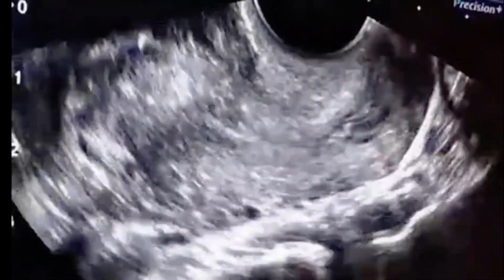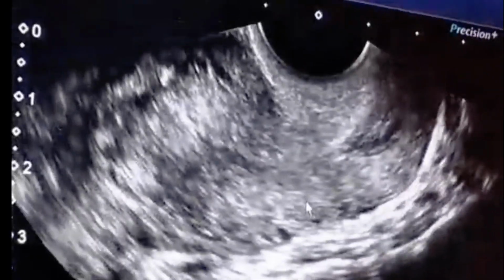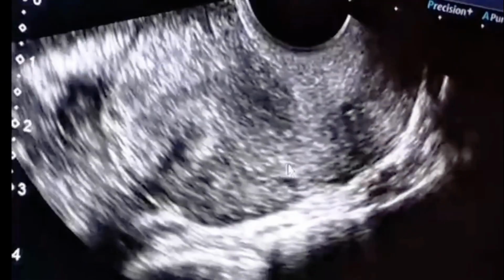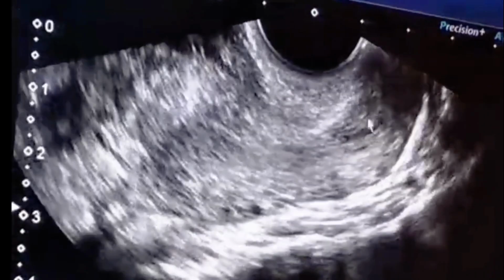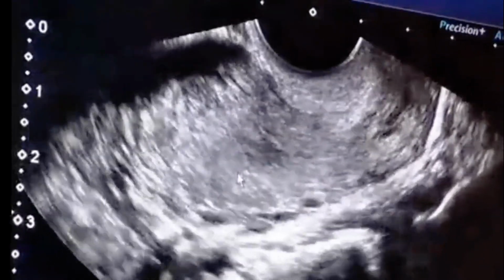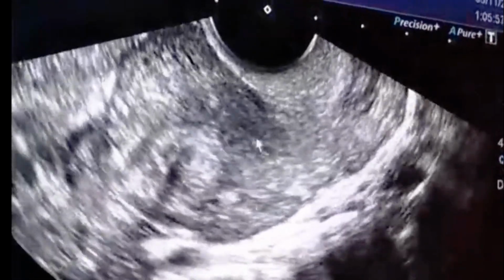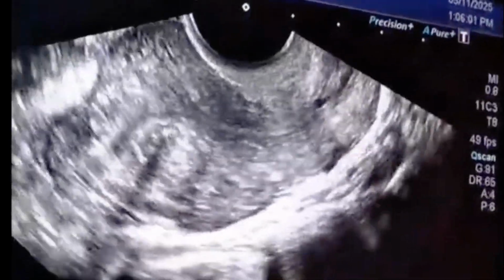This is a case of infertility, a 5-year married female. You see this is the echogenic lining in the middle of the uterus, and this is the endometrium. This is the cervix, and the white lining is the endometrium. You see there are two other white areas in the myometrium, posterior wall.